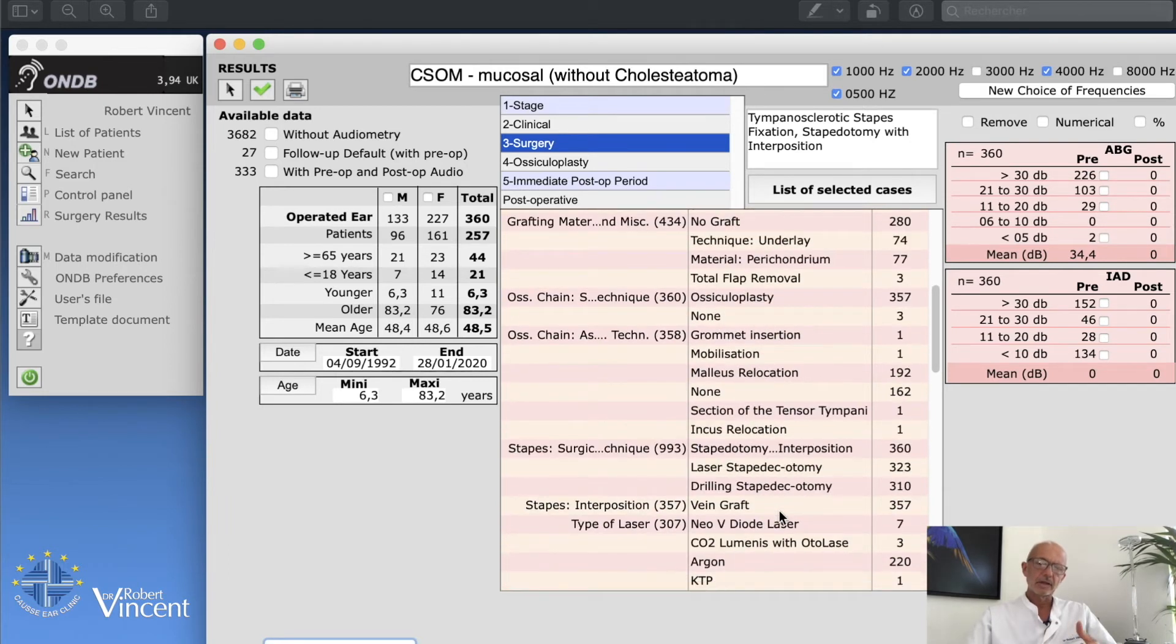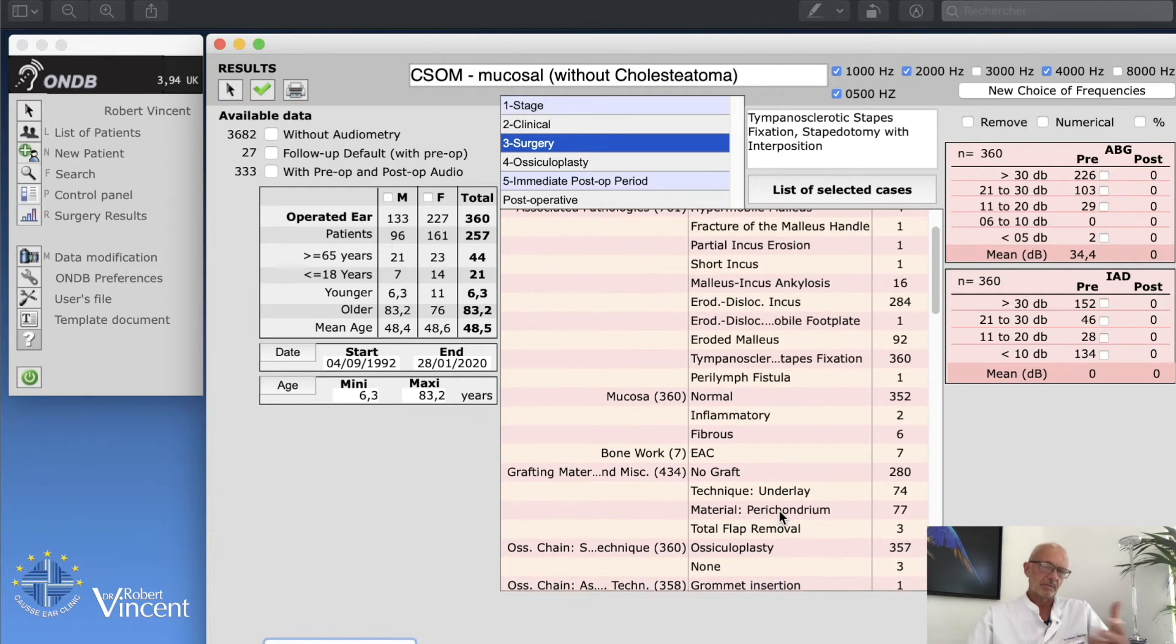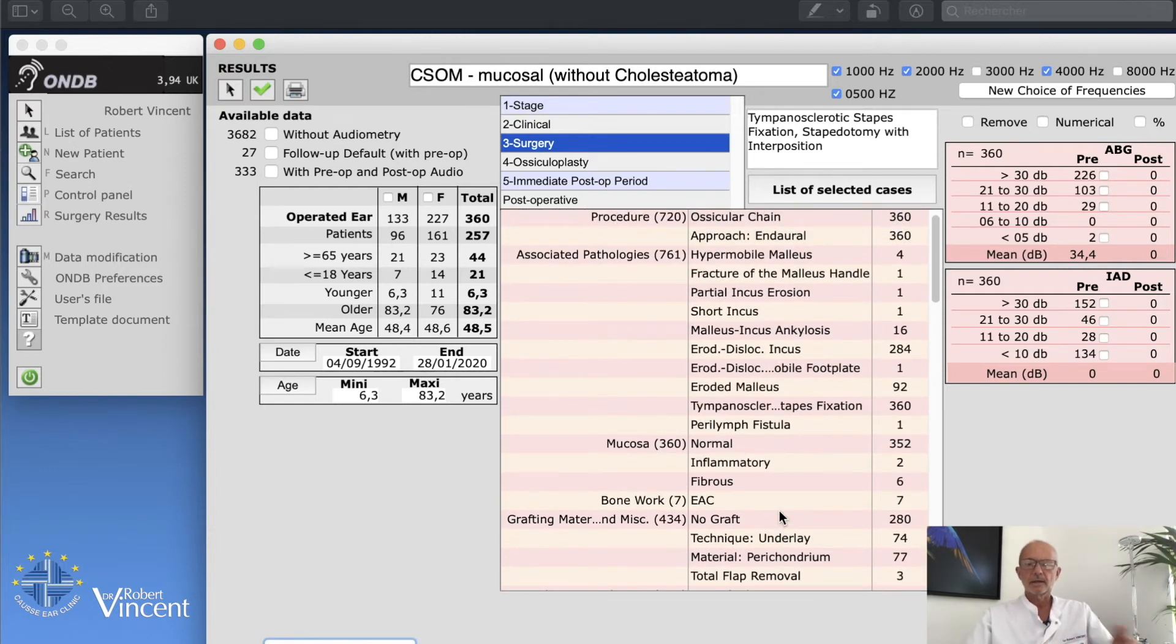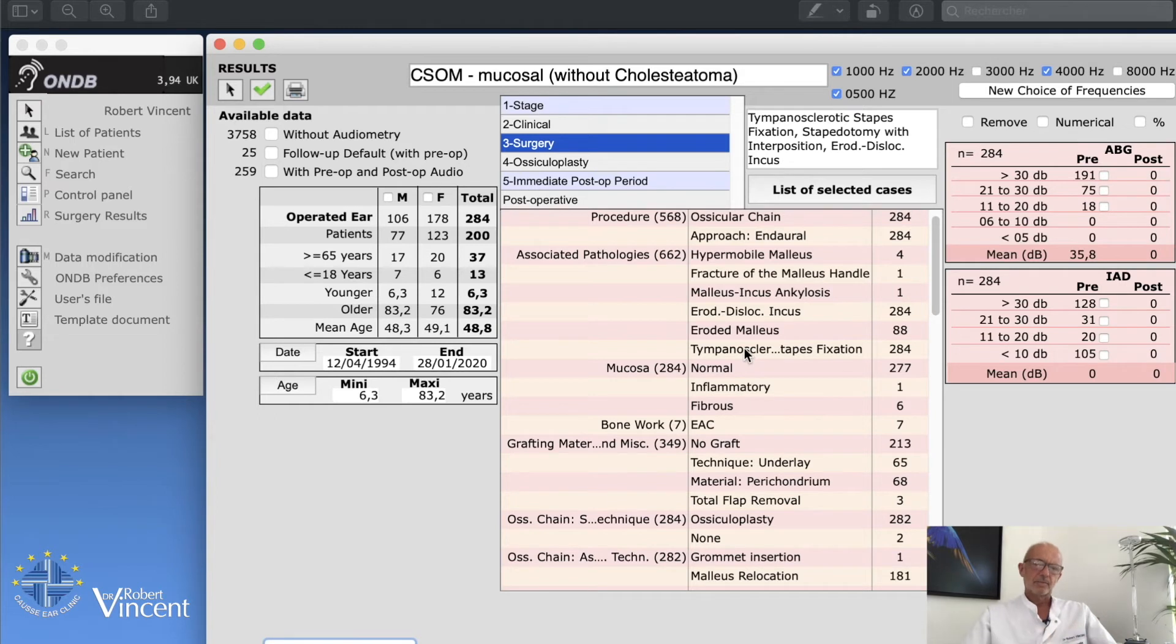I really need to select definitely the cases where there was only an incus erosion. That's something for example we can study specifically. So I'm going to click on this line, eroded/dislocated incus, and then we have 284 cases. But that's not enough.